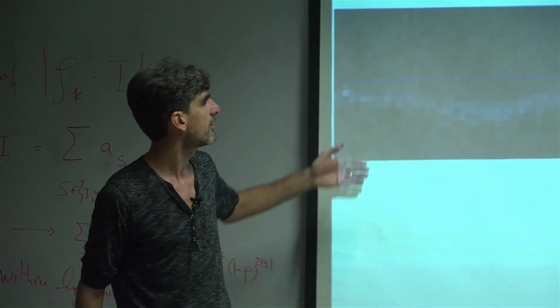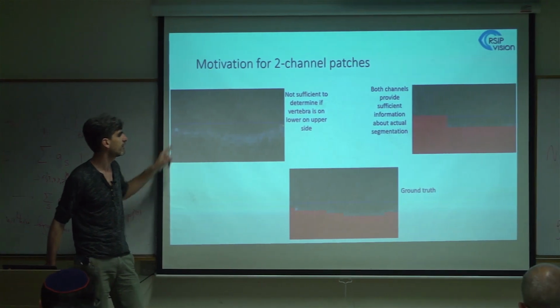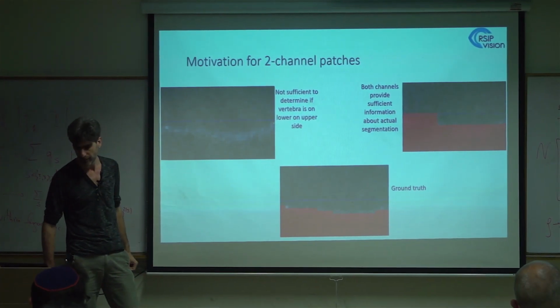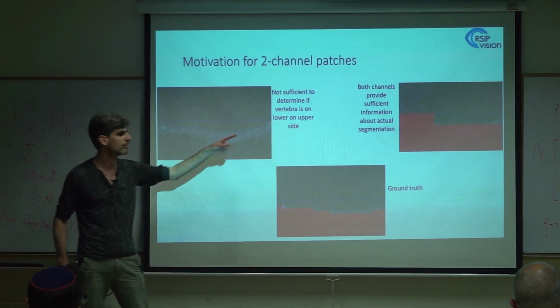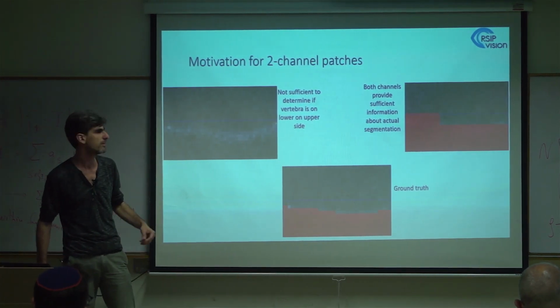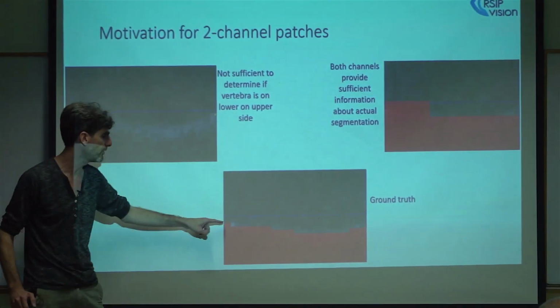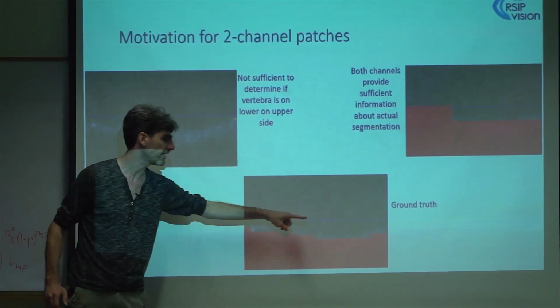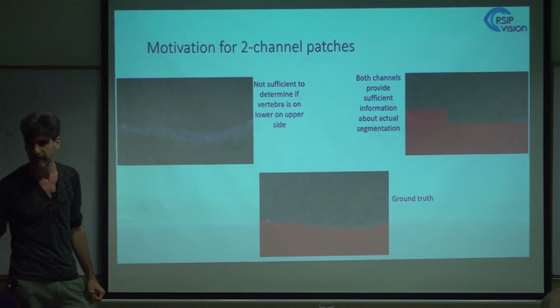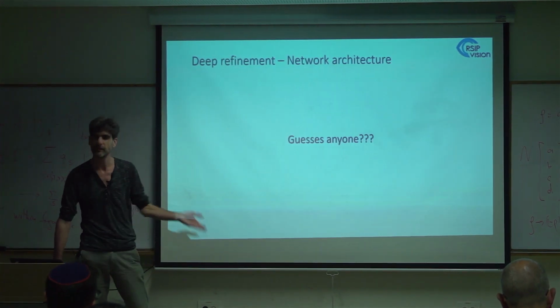So what we do is our input is not only, so this is an example of a pretty bad quality scan. There's a very faint edge. And let's say our input or our initial segmentation is the one on the right. And actually, we're going to use both of these as input. You would think this would be very helpful for the network. Actually, the only thing it really helps it do is to know which part is inside and which part is the outside, and to get an exact segmentation. That's the main benefit for using the rough segmentation as an initial input.